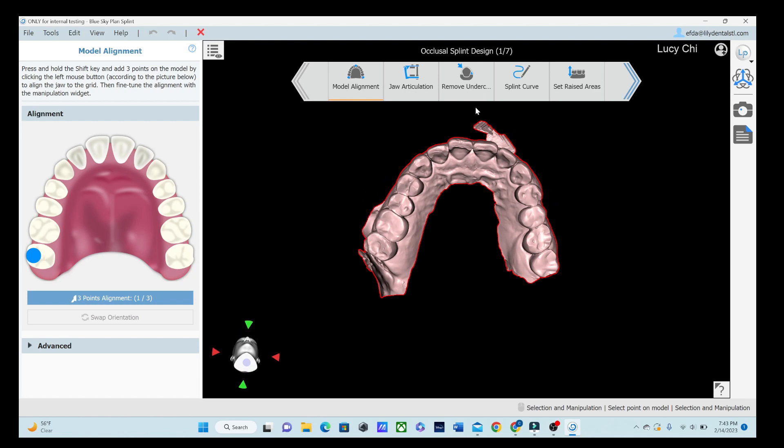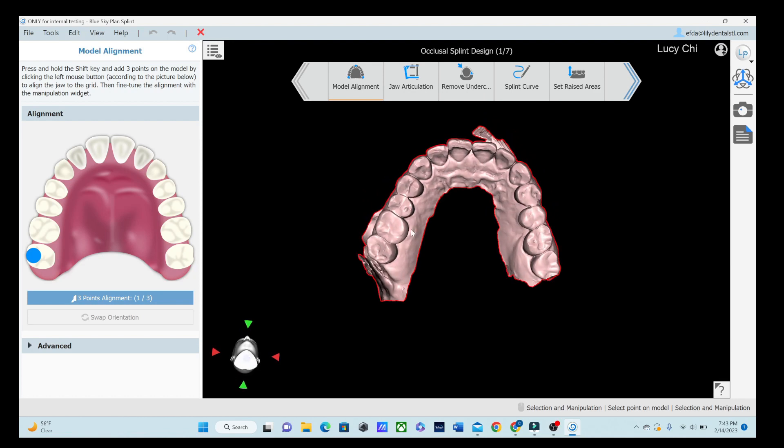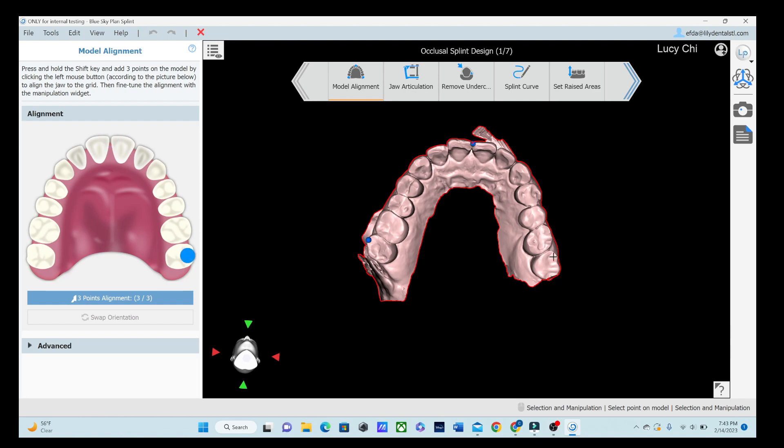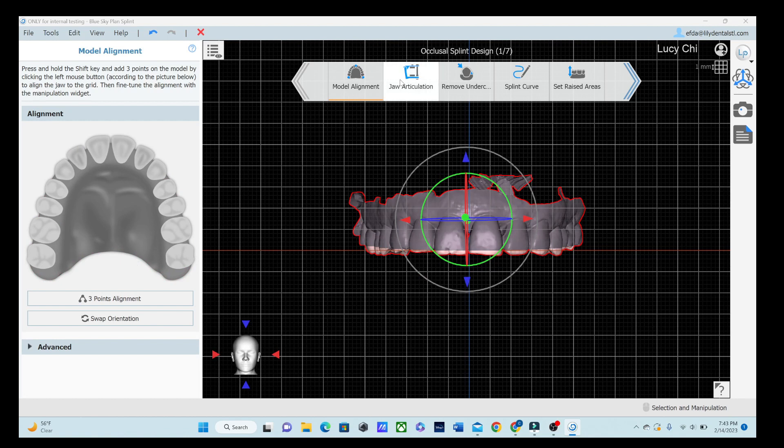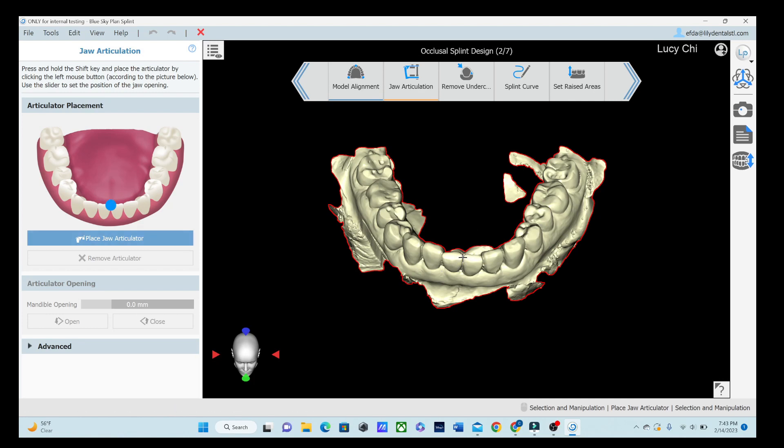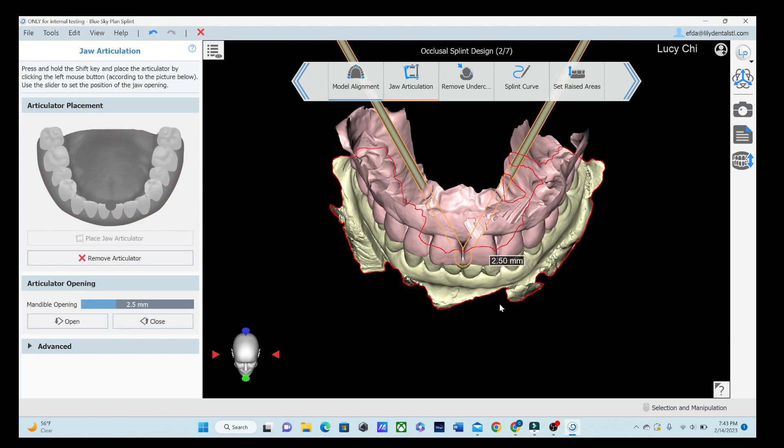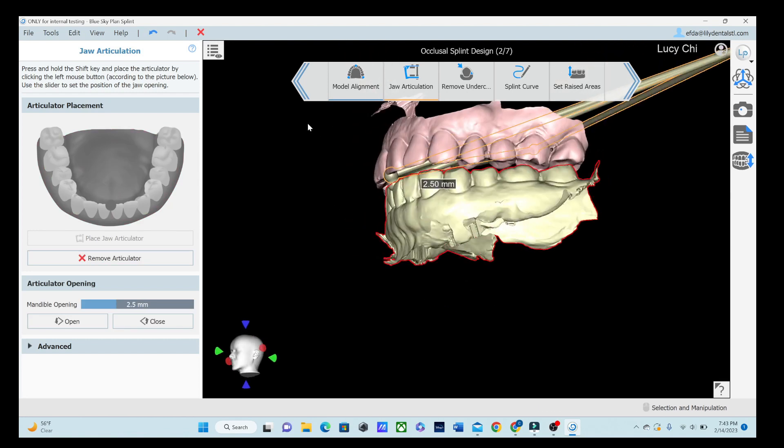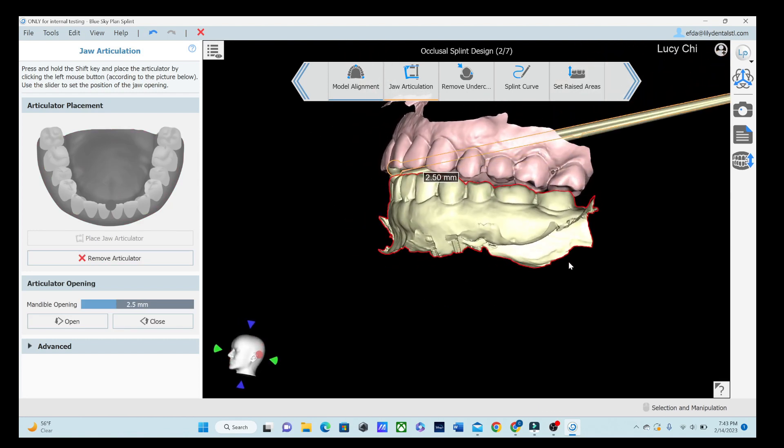Just like always, we're going to do that three-point articulation. So shift-click, shift-click, and shift-click. So we've got our model all aligned. And we're going to tell it where we want it to place the articulator right at the midline, just like it shows over here. Super user-friendly.